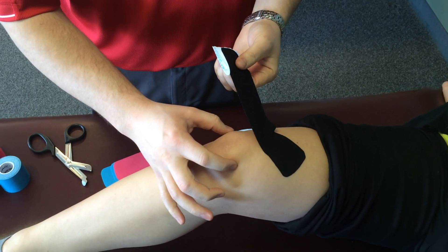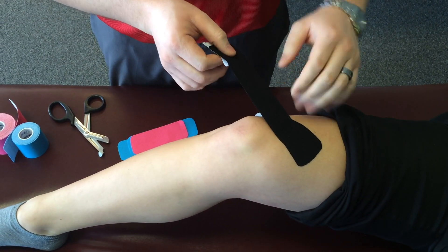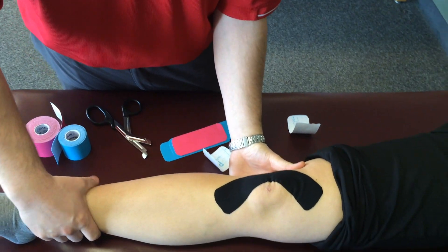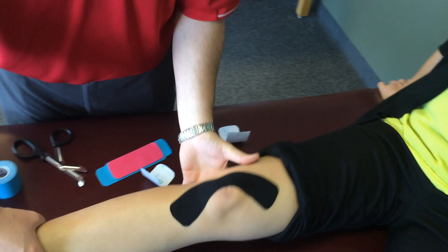Presuming that her dysfunction is one where the kneecap is moving laterally or outwards, I'm going to try to capture the outside aspect of that kneecap in a slight bent position. I can straighten that and make sure it's going to work fine, bend it all the way up, make sure that it moves just fine.